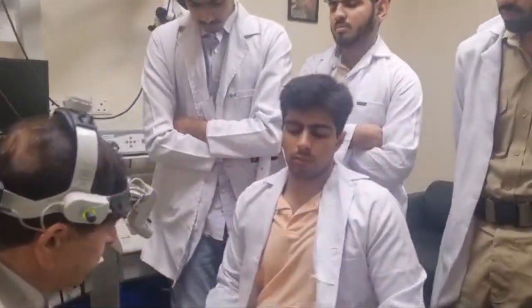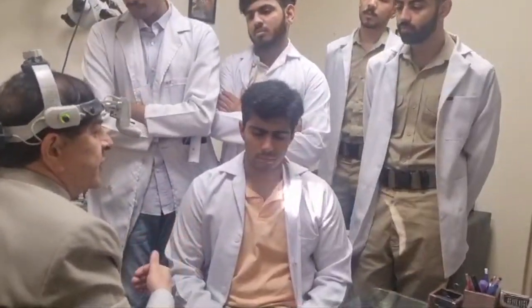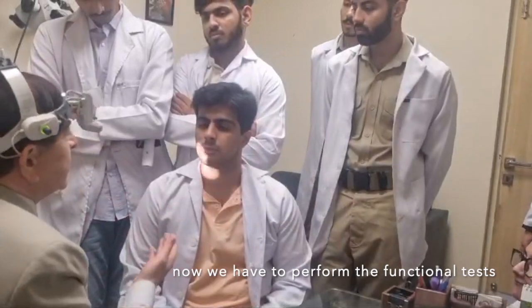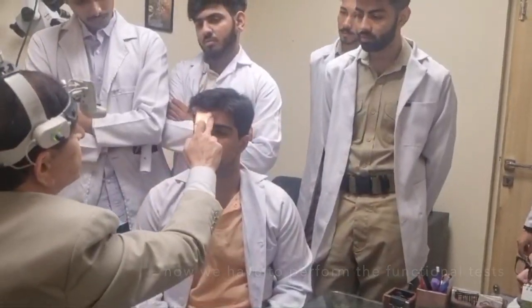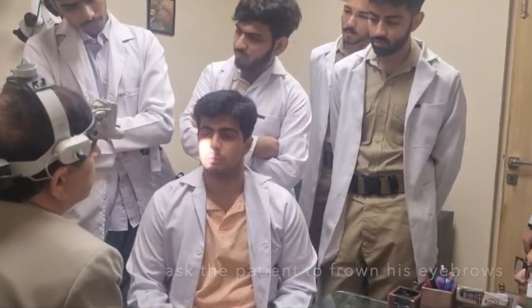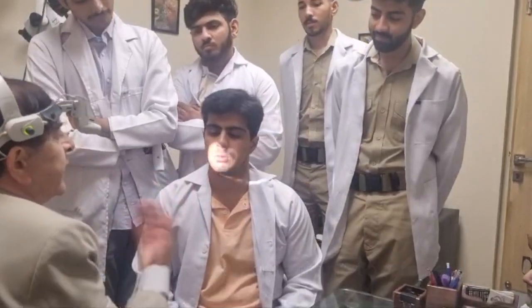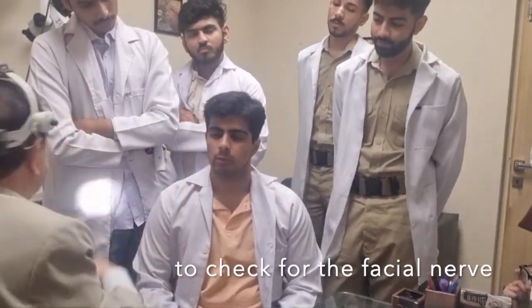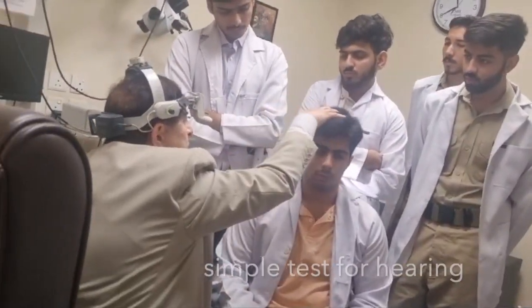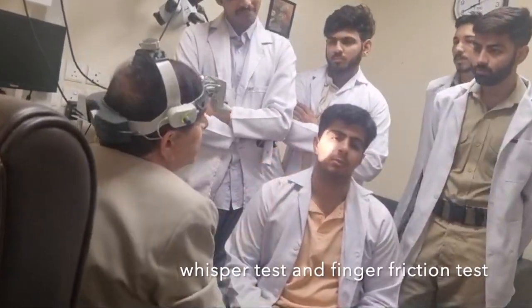Since we have the problem in the left ear, we have to do the internal and external examination. Now we have to look at the functional tests. The functional tests cover three things: facial nerve, and next comes vestibular and cochlear. First we do the simple tests — whisper test and finger friction test.